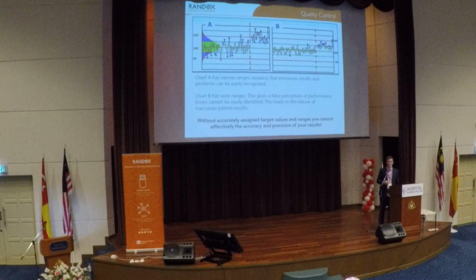According to ISO, the most accurate targets and ranges you can use will be using your lab's own running mean, so assigning your own target values and ranges. However, it's also important to make sure that you're using controls from a manufacturer that already provide accurate targets and ranges.